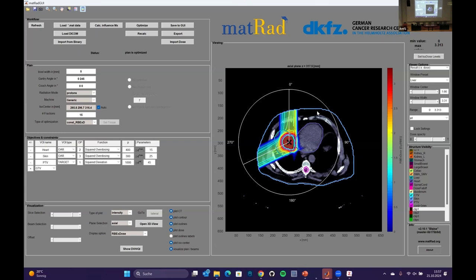Of course, with a clogged nose, the doctor would see me and say, this might be an issue with our planned treatment, please come back when you're healthy again. But think about something like the liver here. There's lung moving, inflating and deflating. There is maybe something in the bowels that just moved. In prostate treatments, it could be that there's suddenly gas in the rectum, a gas bubble coming through. These are things that you do not see live because you do not do live imaging. So uncertainty is a big thing, and we can kind of simulate something.